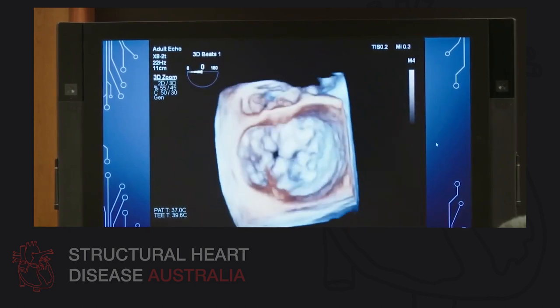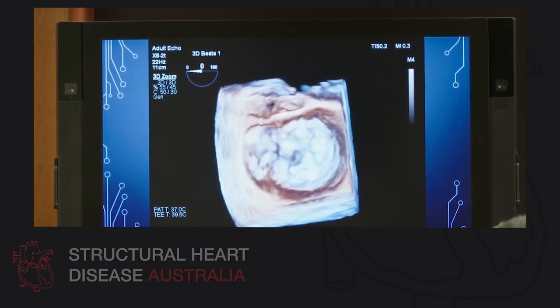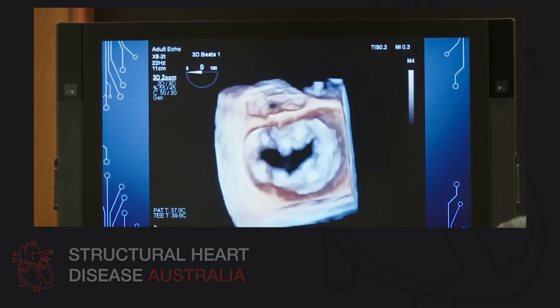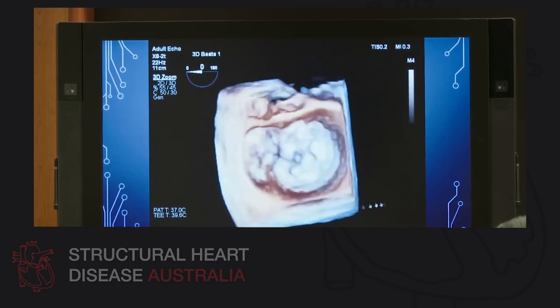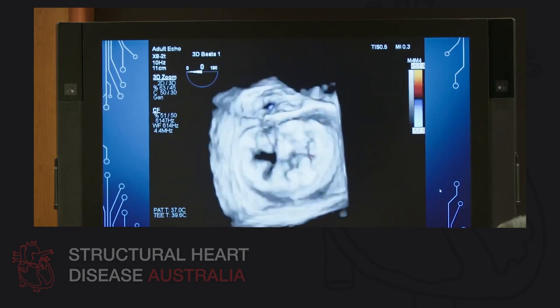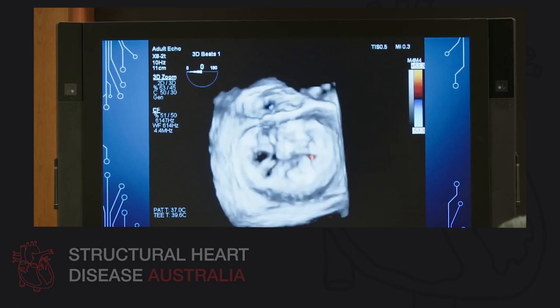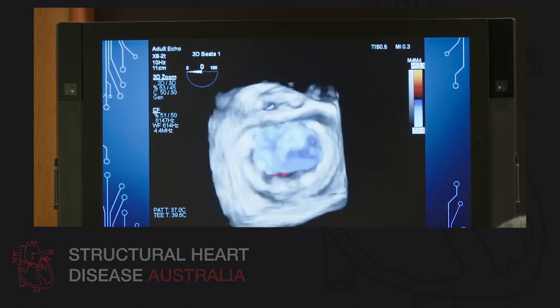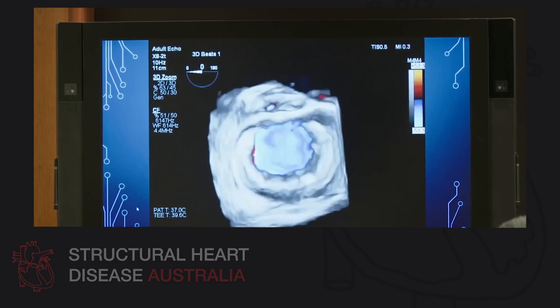So this is confirmed on the 3D image. With the 3D image, I'll just point out to you, this is the anterior leaflet and the posterior leaflet, and this is aortic valve at the top. This is the lateral side. So if we just get this to run, we can see that the valve is thickened and it looks like there's a central coaptation defect, and that's confirmed on the next image, which shows the color. And so we can see that there's a central origin color jet. So this is A2P2 central origin jet, which is related to predominantly degenerative change of the valve and some degree of prolapse in a ventricle that's of normal function.